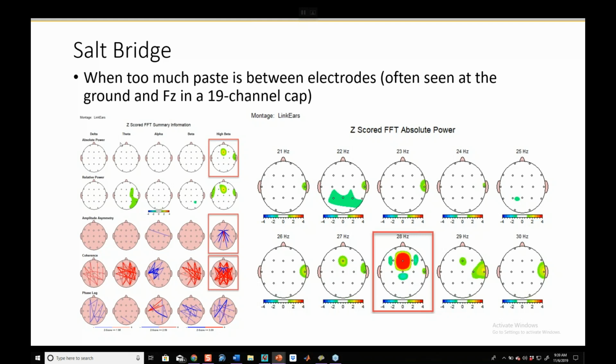When you see a 28 hertz spot, like we do here, for instance, at any electrode for that matter, or another subharmonic of electricity, a 16 hertz spot, and it's going to be focal like this, it's going to be really mad, really hot at those frequencies, know that you have a subharmonic of electricity. In a spectra, it would not have what's called kurtosis. The spike that represents that 28 hertz at FZ, it wouldn't have sides. It would just kind of go bink, bink like a needle. And so this is not real.